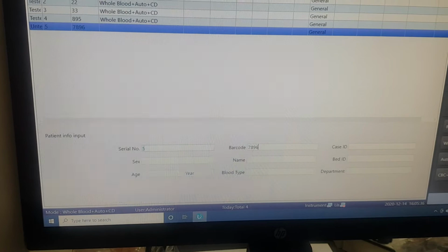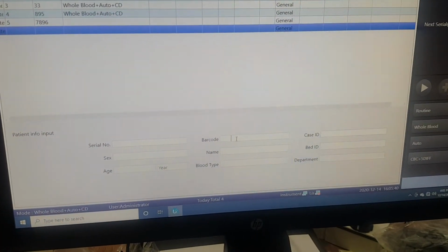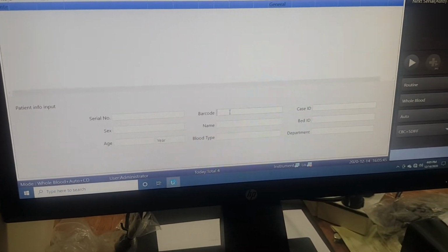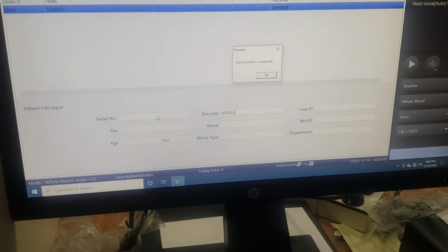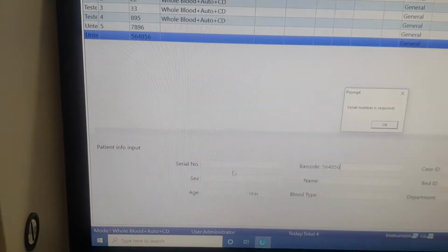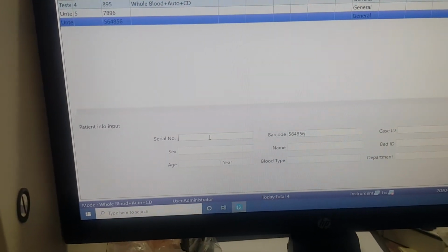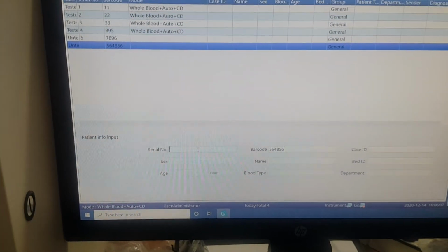We cannot remember the serial number all the time, because now if I put here something and we need to put the serial number here, we don't know what the serial number is. In the next serial ID it shows 5, but we already have 5, so we cannot put 5 here, we need to put 6. But how can I remember every time when we have many samples? This is issue number 1.